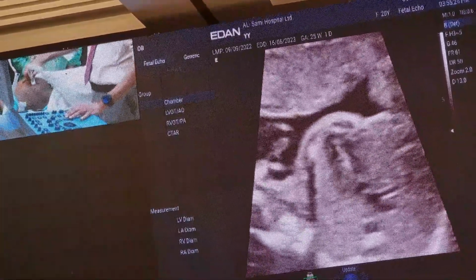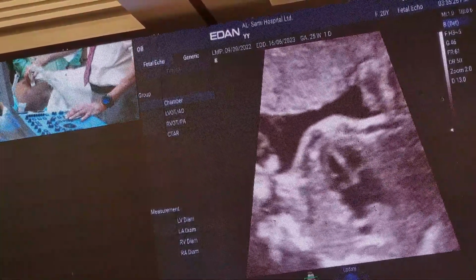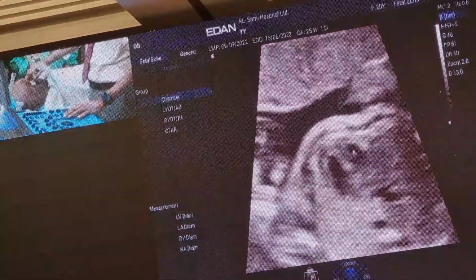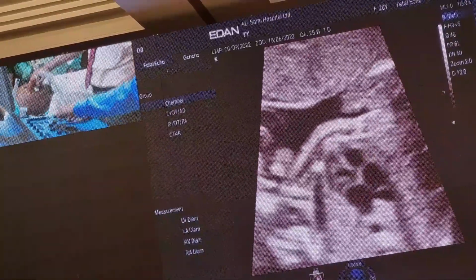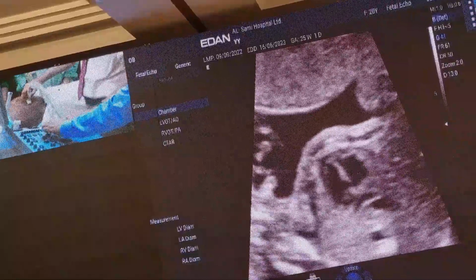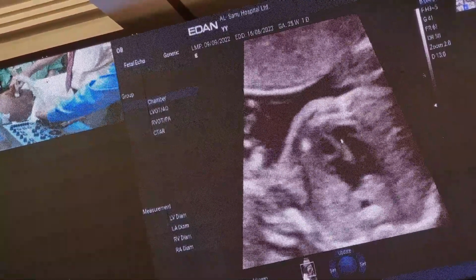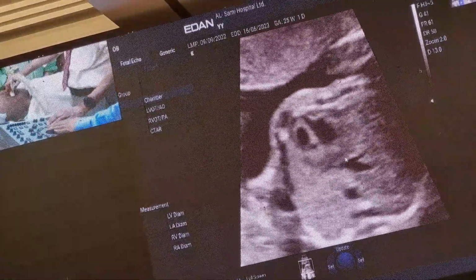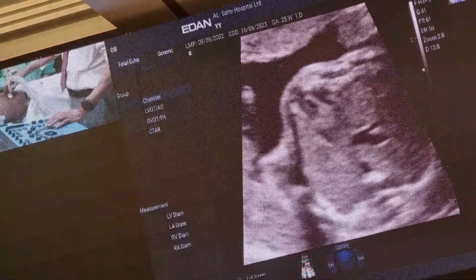And then we have the four chamber view here, and we will just identify the chambers. Some important landmarks when you're looking at the four chamber view. The rib has come in between. Can you make it big, zoom, zoom. As Joyti said, we have to magnify so that we make sure that we have one rib around it. I can see one rib, that means I am not in an oblique position.